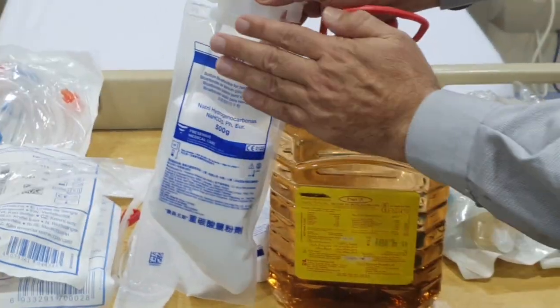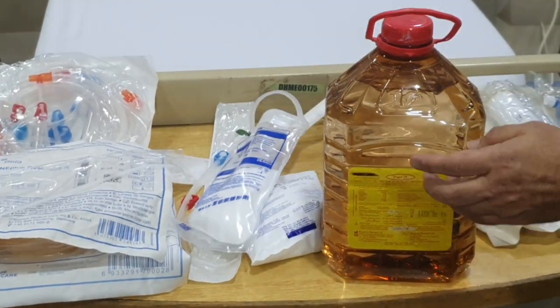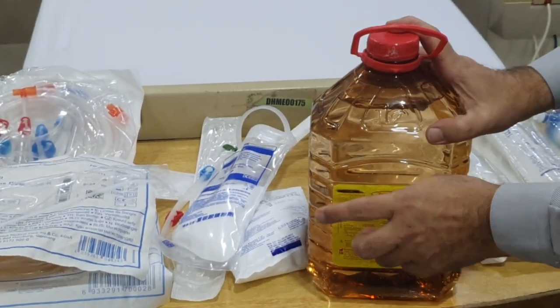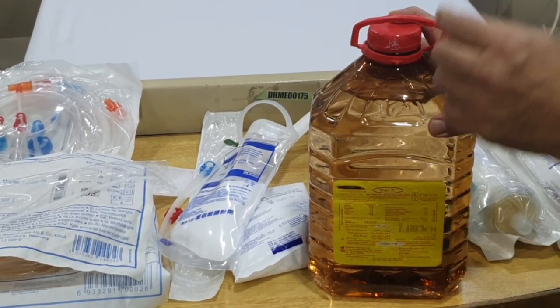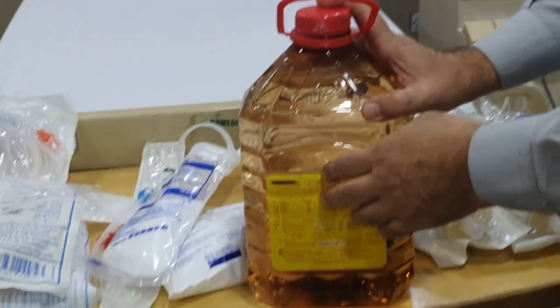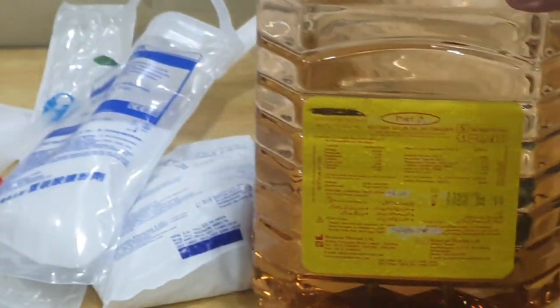So you've got different numbers here, and there are a few readings here, and they tell you what things are in this one, because remember, this has to mix with this. So they're together. In this packet, we've only got bicarb. In this packet, we've got acid. The acid has got different things in it. You've got calcium in it, you've got potassium in it, you've obviously got sugar in it. You need sugar in order to maintain osmolality. If you don't have any sugar, the person will become hypoglycemic.